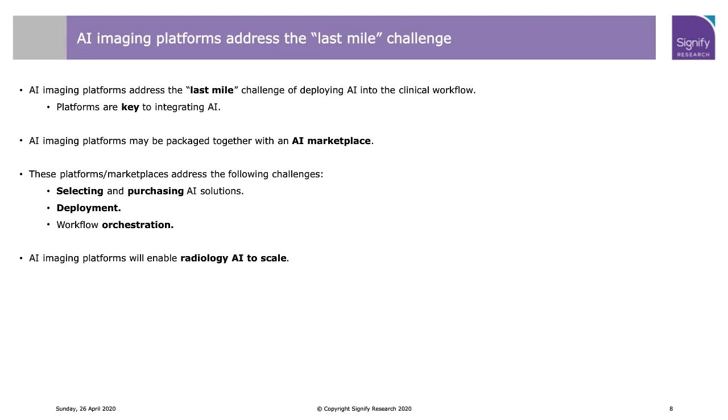One of the key issues addressed by AI imaging platforms is the last mile challenge, and that is to deploy the AI solutions into the clinical workflow and offer orchestration capabilities. As AI becomes more commonplace in radiology, platforms will be key to the seamless integration of AI in the workflow. AI imaging platforms may also be packaged together with AI marketplaces.